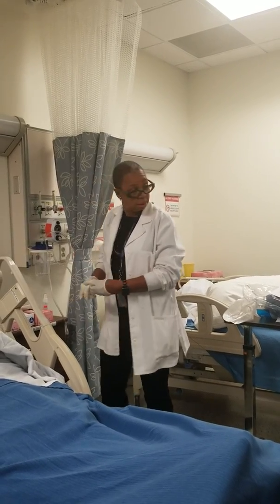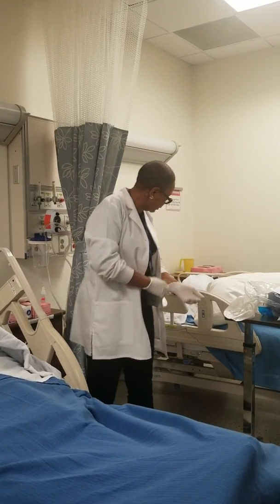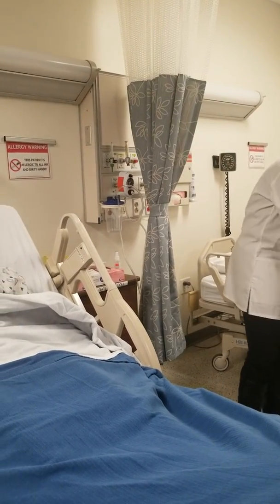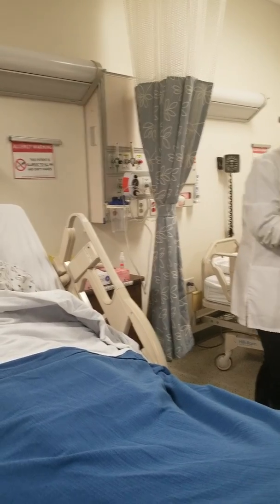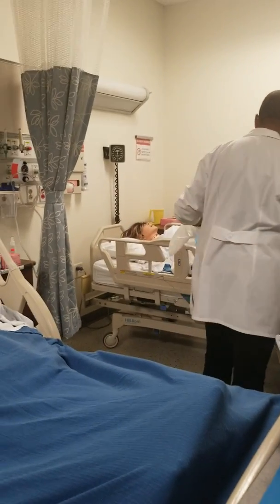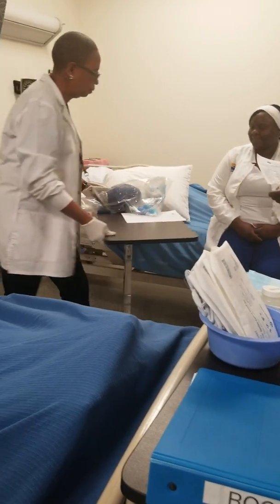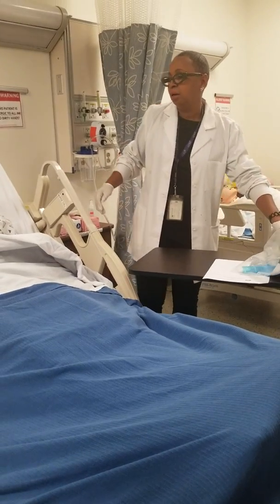Did y'all lock the bed? Go ahead and lock the bed. Does somebody know how to lock the bed? Push the red tabs. Let's see, can they lock the bed? There you go. It's this one that needs to be locked. Look, they locked the bed. Look at this stuff we're learning today. So hold this, I'm going to need this to work here. I'm going to need my bedside table. I'm going to start setting up.